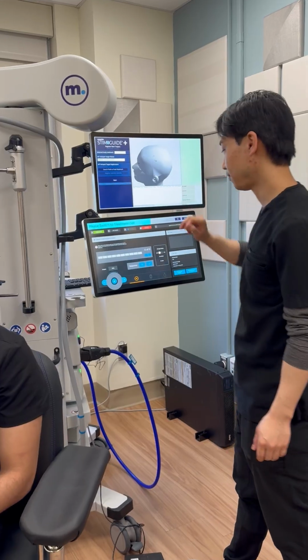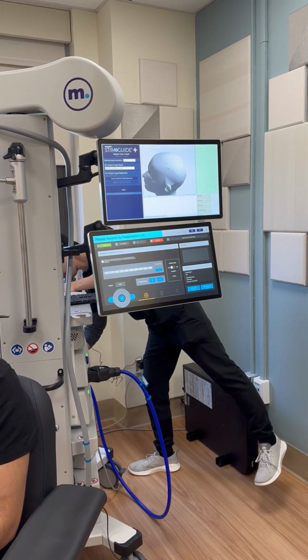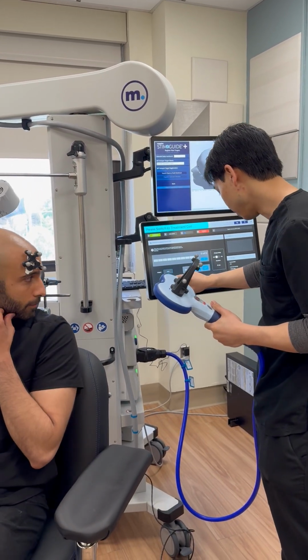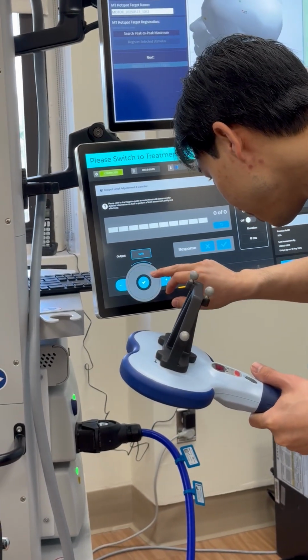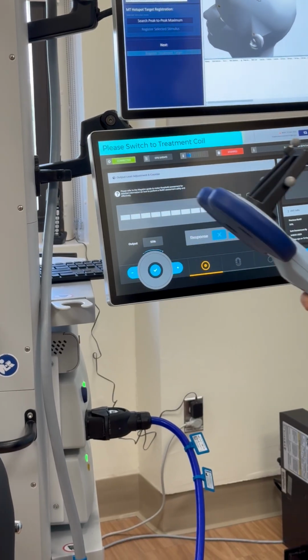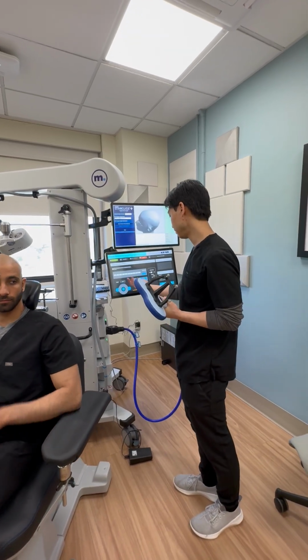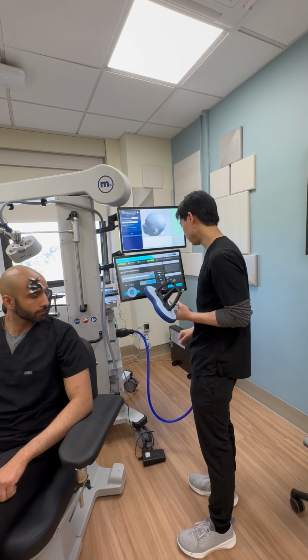So next we're going to define the motor threshold. So we're going to get our MT coil. We're going to increase this to about 55. And depending on if the patient needs a higher percentage, you go up or down based on that. So we'll prime the machine.